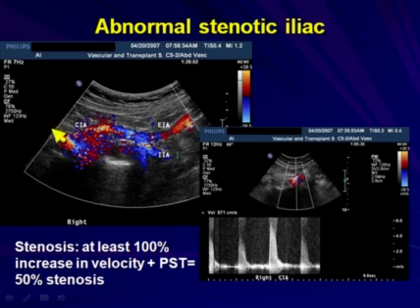This is the kind of disease we want to document. You can see there's a huge aortic, common iliac bruit here that is causing all of that color speckle within the area, but this is from a severe common iliac stenosis. We can see here that this is over 500 centimeters per second, certainly a hemodynamically significant stenosis by anyone's criteria.